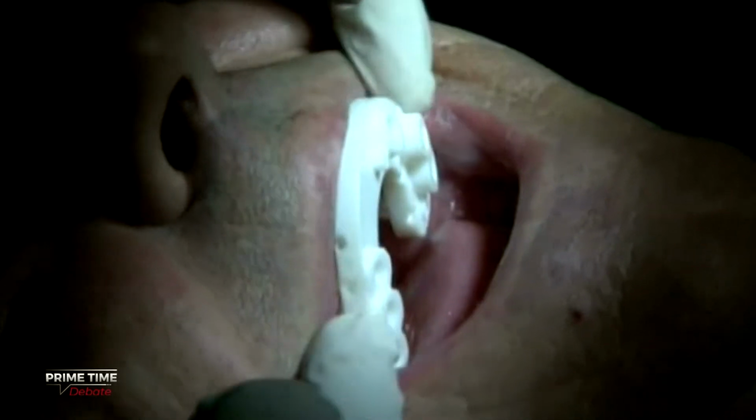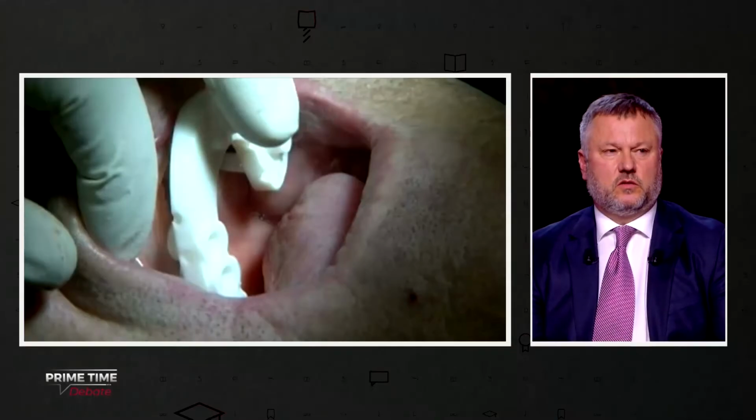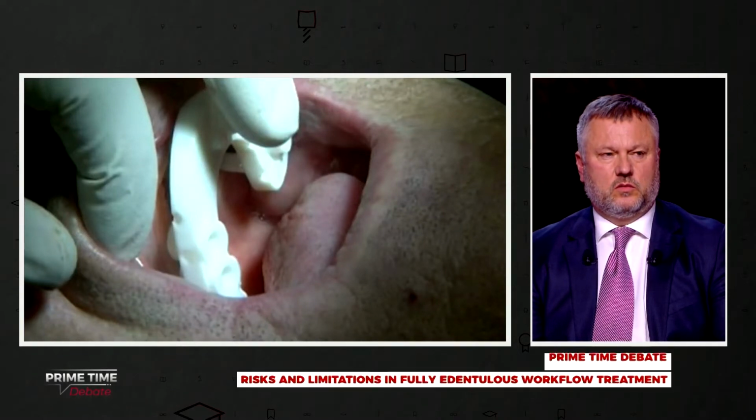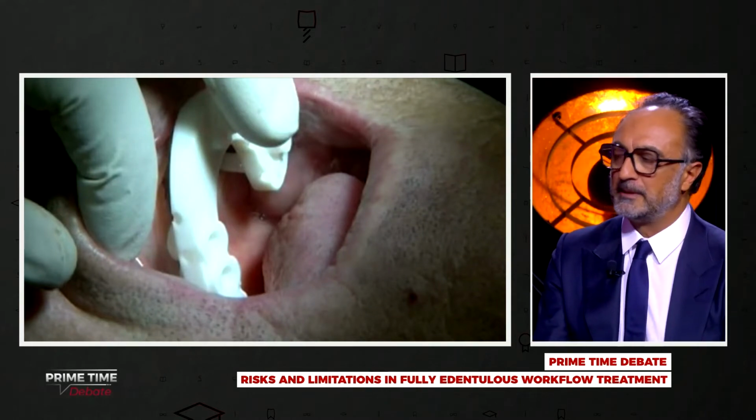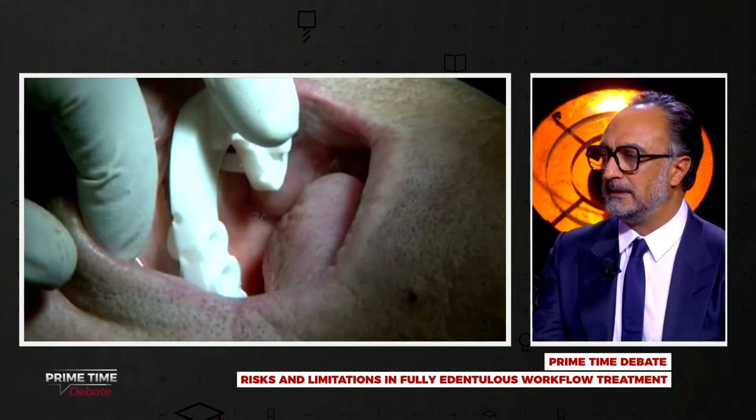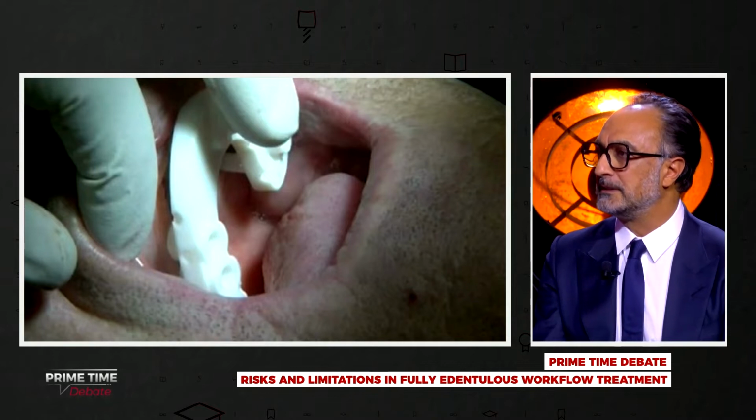Are you waiting for osseointegration? Are you using them more like orthodontic? No, that's a good point, Bjarni. We don't wait for osseointegration. We don't want to keep them in the mouth. So you have to be quite fast during the protocol. Everybody has to be ready. In our study, we waited sometimes 3-4 weeks, but then you have a chance to lose an implant. If you lose one, it's okay, but if you lose 2, you have to start over again.